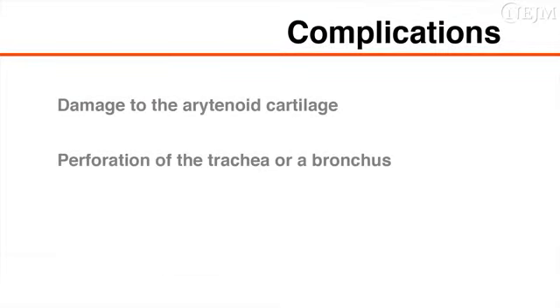If the steps described in the video are followed, severe complications, such as damage to the arytenoid cartilage by the tube, or perforation of the trachea or a bronchus by the airway exchange catheter, are unlikely to occur.